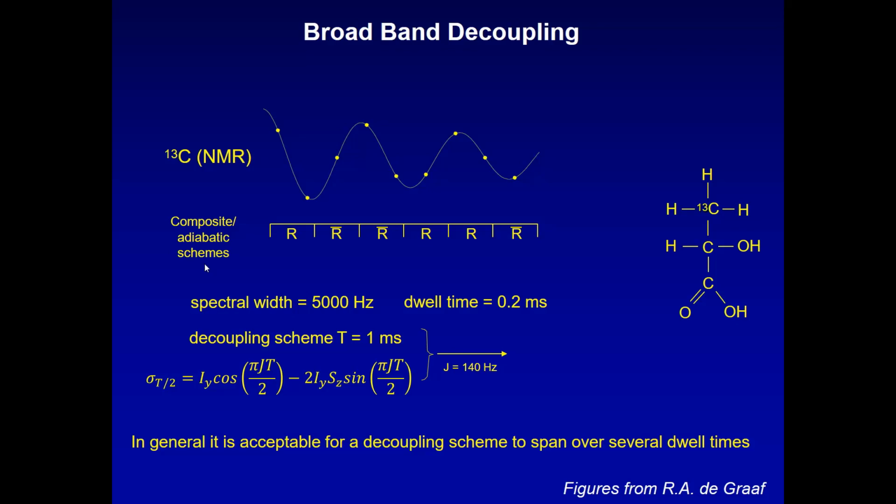This is a set of hard pulses put together, with very particular pulse angles and timings to achieve this apparent randomization of the proton nuclear spins being in the up or down orientation. This can also be done with adiabatic pulses.